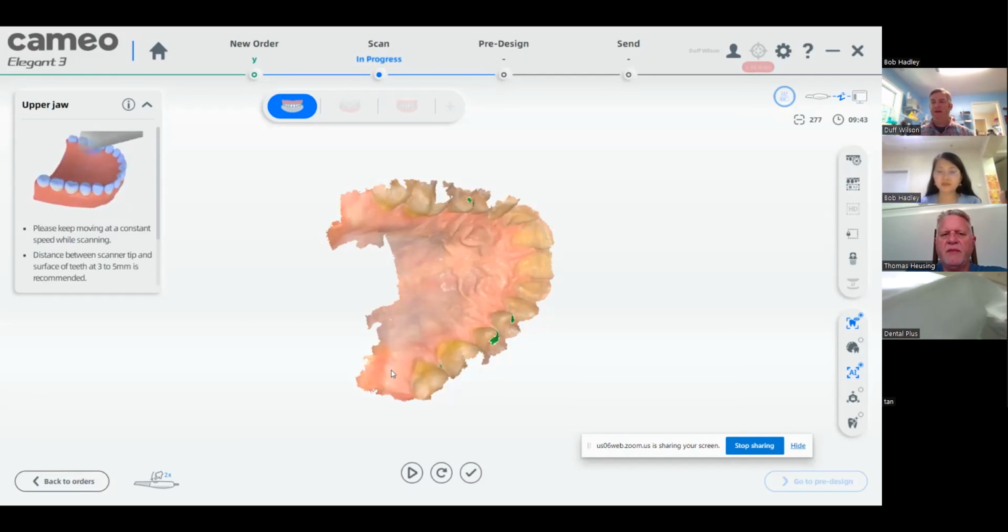After they're printed, we run them through another software like Meshmixer or whatever, and smooth out the intaglio aspect of the model, or the inside, because they'll have some bumps in there that our printer doesn't like. But as far as any of your parameters, we don't print any with dies. All of ours are solid models anyway. So I don't have any information for you on parameters for model work.